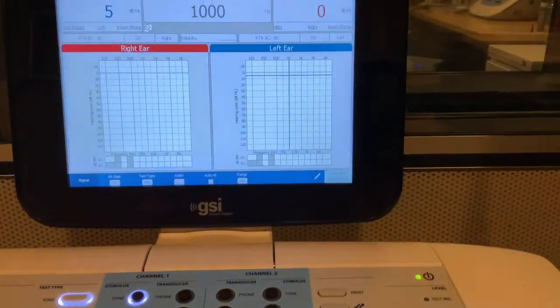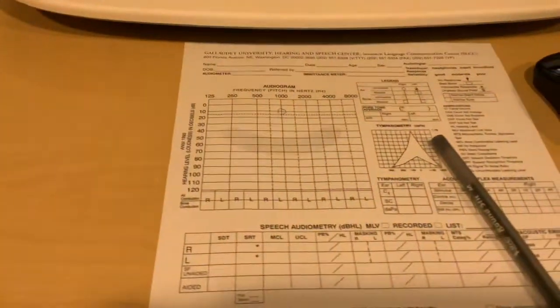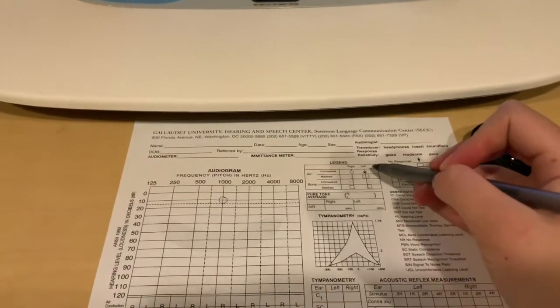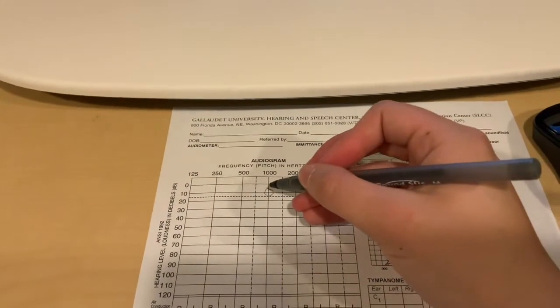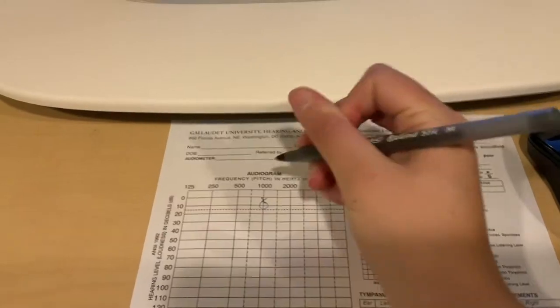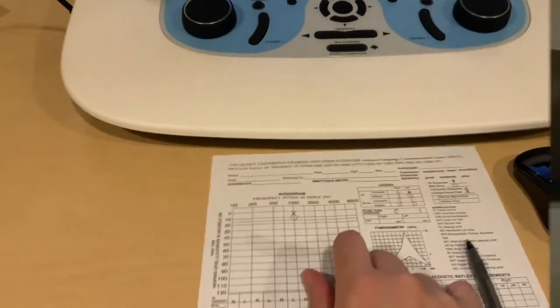And again, we can see that in the little crosshairs on here that we'll just transfer to the sheet. The symbol for the left ear is an X. So at 1,000 hertz, at 5 dB, we're going to write an X. Okay, and then you'll go across each of the frequencies and do that same thing.